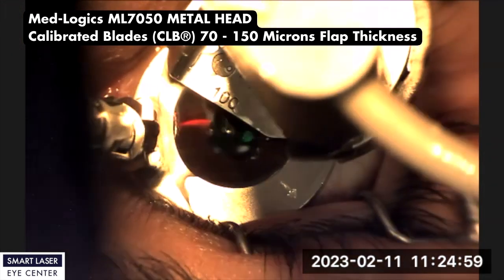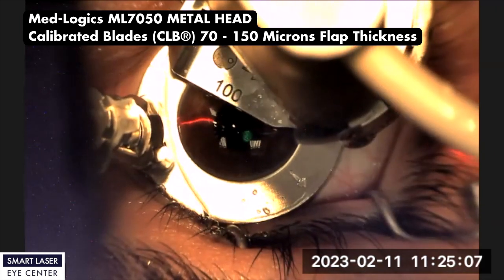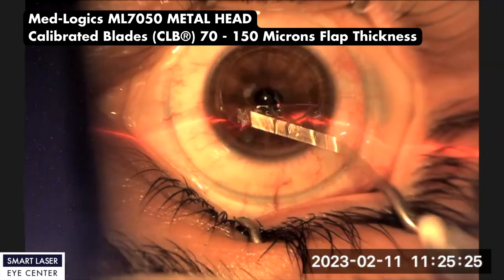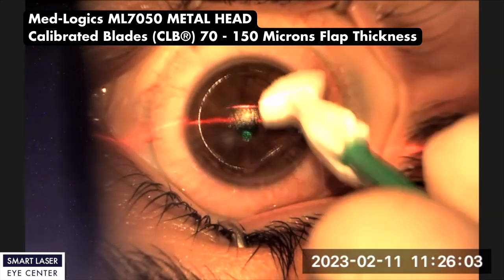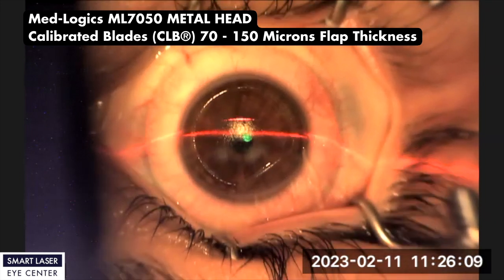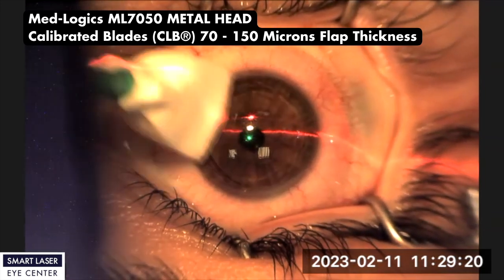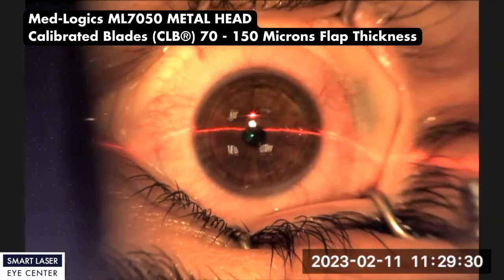Now you can watch the ML-7050 metal head with calibrated blade flap creation surgery video. You can see the cornea and flap border cutting difference. The cornea border is looking very natural and smooth, and now the stromal bed is ready for laser shooting. After laser shooting, the surgeon closes and places the flap exactly where it was. Cornea and flap borders are looking very smooth.